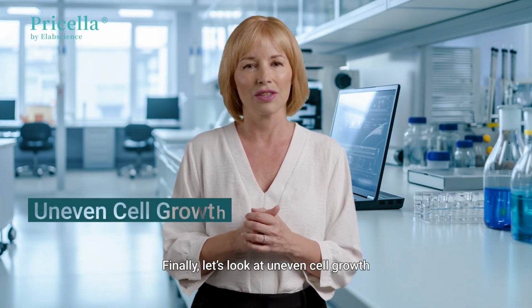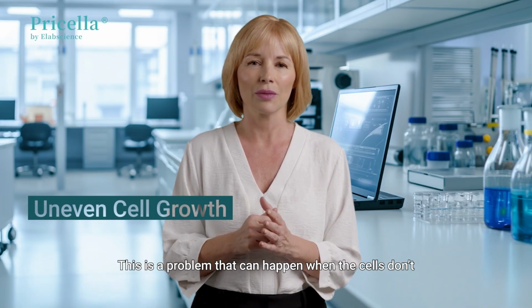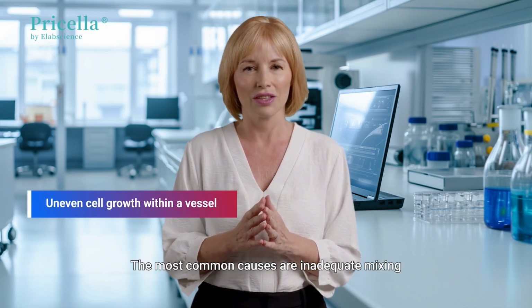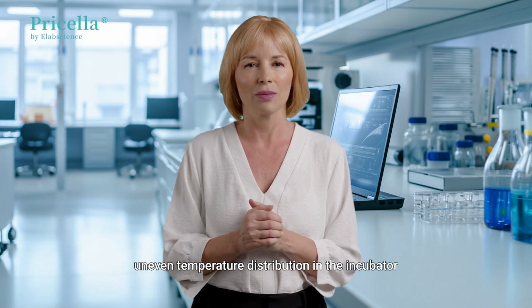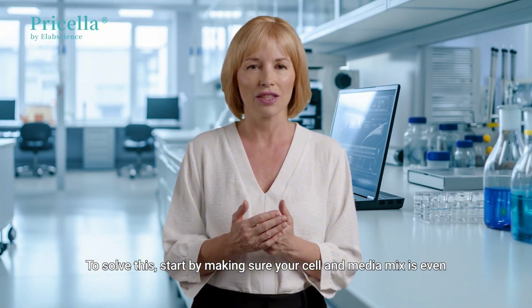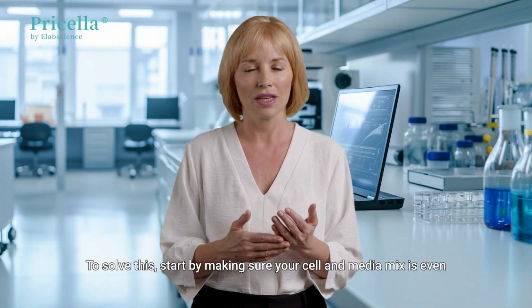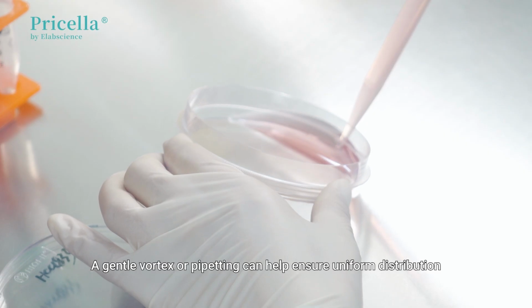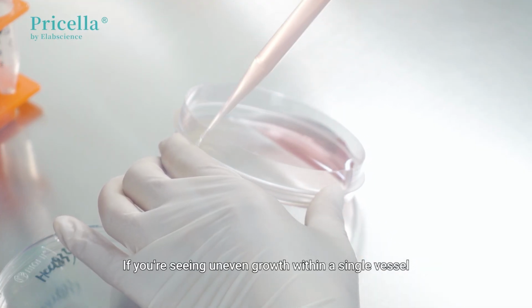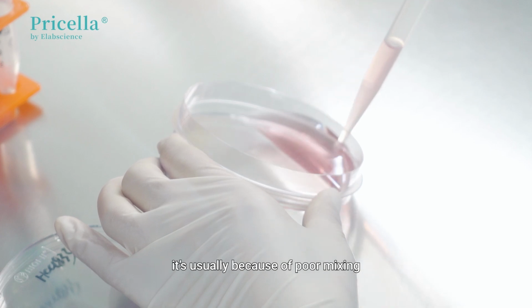Finally, let's look at uneven cell growth. This is a problem that can happen when the cells don't grow uniformly within the vessel. The most common causes are inadequate mixing, uneven temperature distribution in the incubator, or the presence of air bubbles. To solve this, start by making sure your cell and media mix is even. A gentle vortex or pipetting can help ensure uniform distribution. If you're seeing uneven growth within a single vessel, it's usually because of poor mixing.